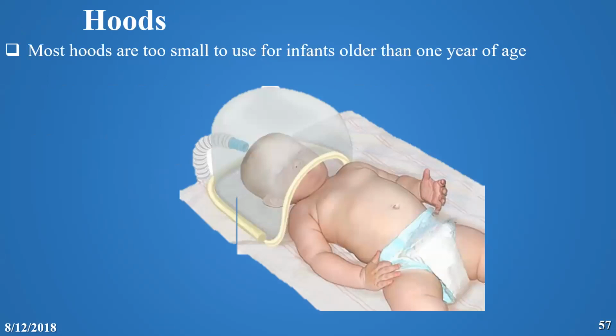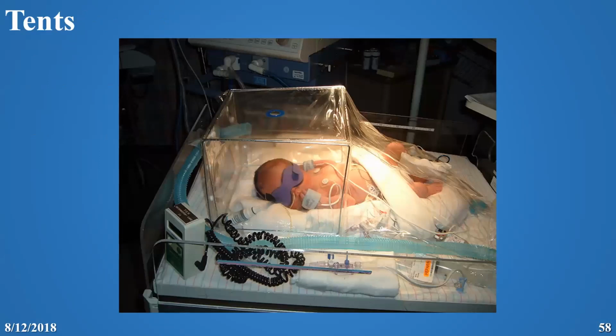So this is an example of the hood. This is a face hood. Okay, we rarely ever use it right now. This is the whole body tent. You can see the tent. It covers the whole body.